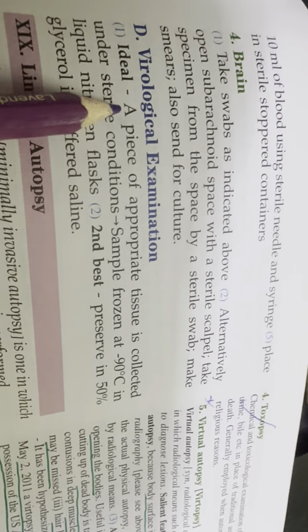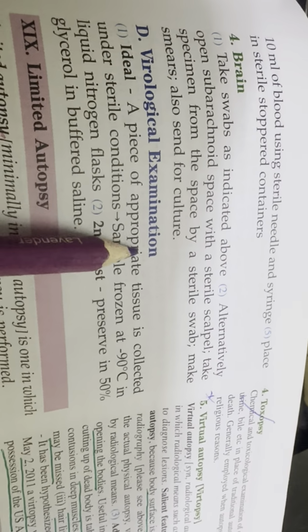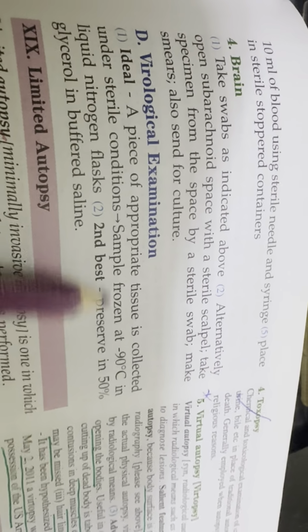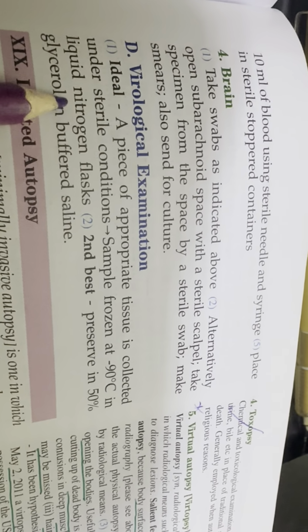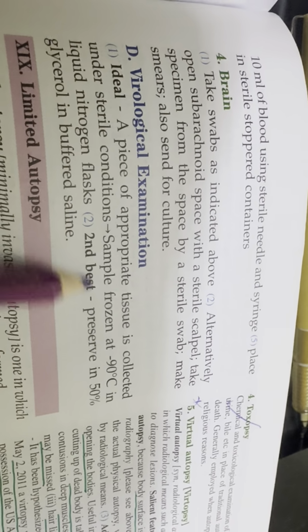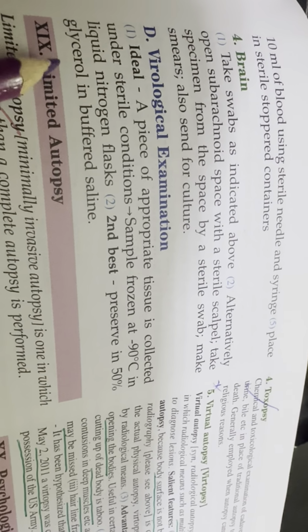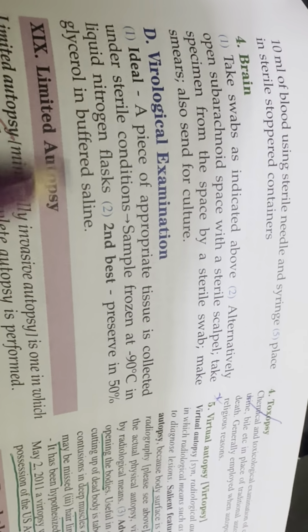Virological examination. Ideally, a piece of the appropriate sample is collected under sterile conditions. The sample is frozen at minus 90 degrees Celsius in a liquid nitrogen flask. Second best, preserve in 50% glycerol in buffered saline.